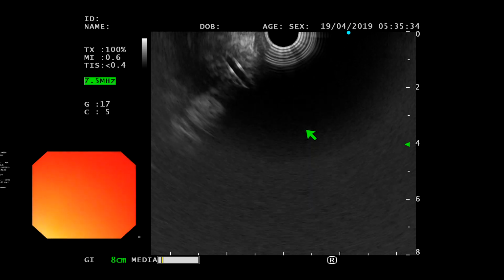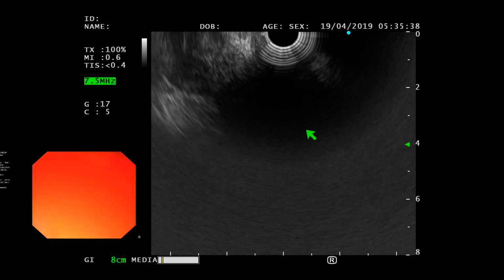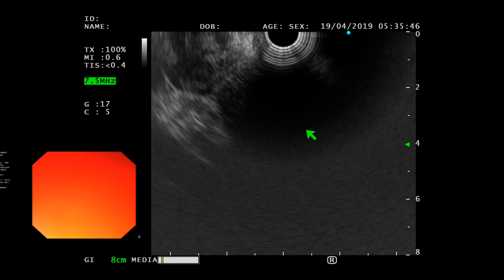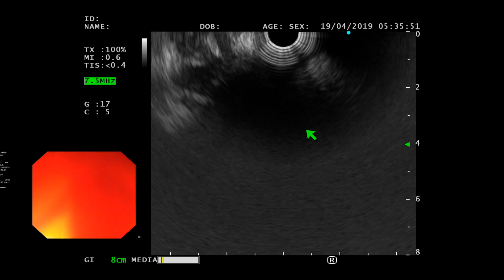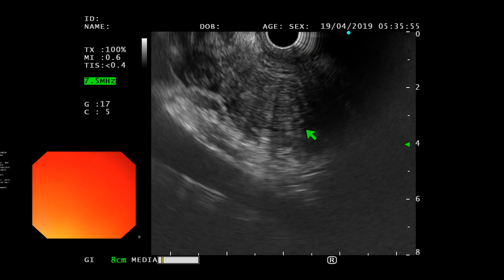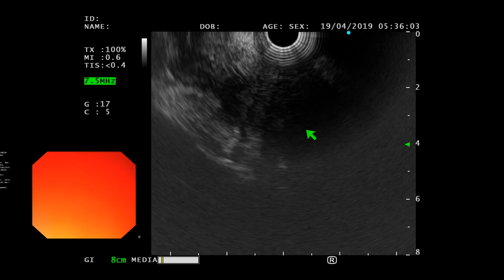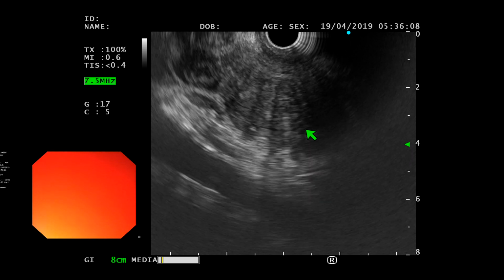Om is asking, once you've done the biopsy, will you keep the Doppler there to see if the bleeding has happened? The answer is no. Yes, thanks. If the cells come, ask them to do TIP, and please do the touch technique as well. Thank you.